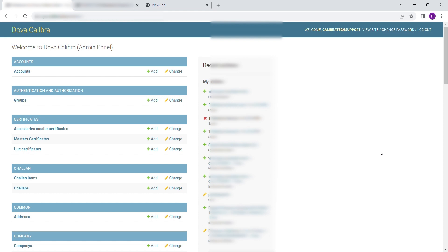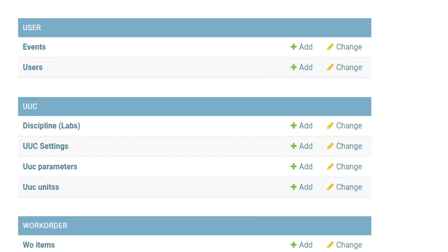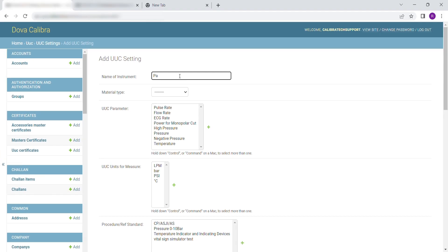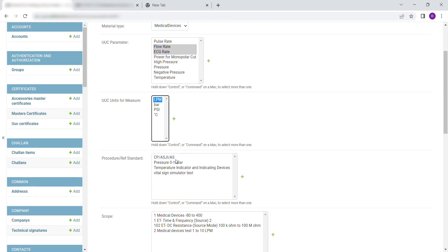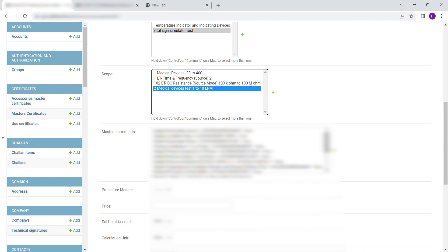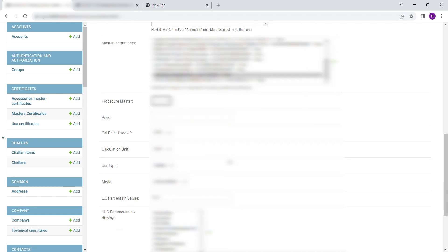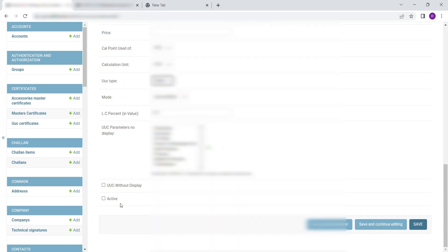To enter UUC Settings, scroll down to UUC. Select UUC Settings. Then click on Add. Fill in the following details: enter the name of the instrument, select Medical Devices from the drop-down, select all UUC parameters, select the unit of UUC parameters, select Procedure, select Scope, select Master Instruments from the list, select Procedure Master, and enter the price for the calibration. After entering the details, click on Save to save the changes.